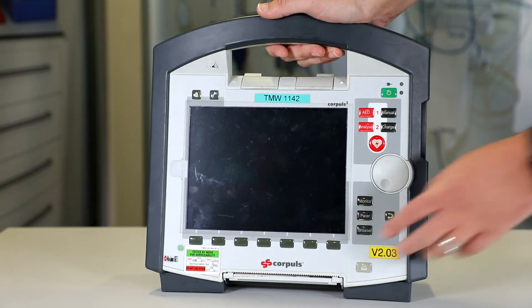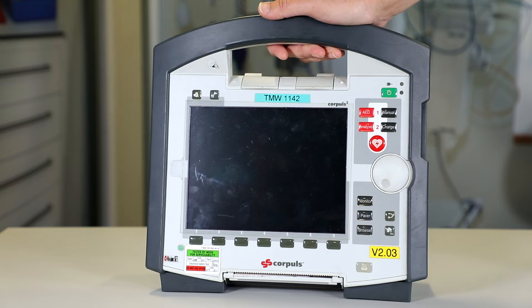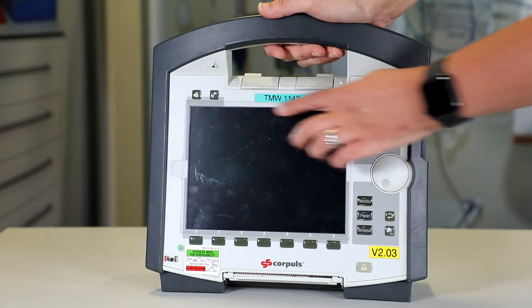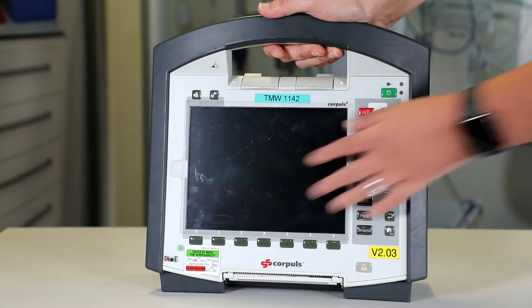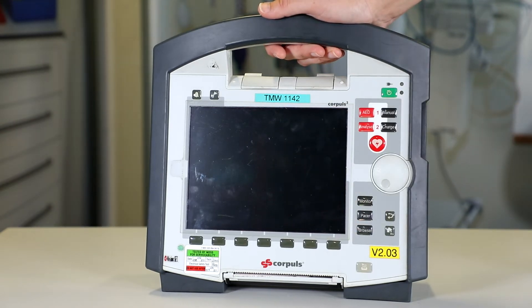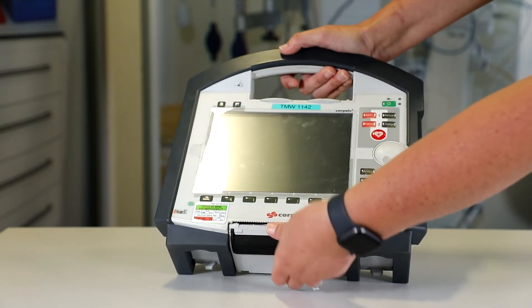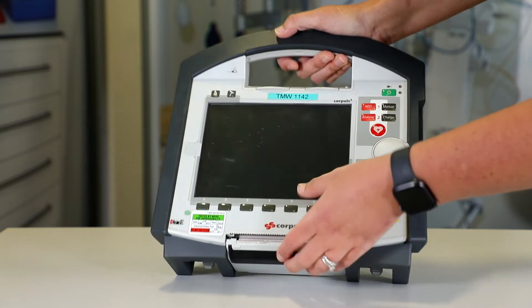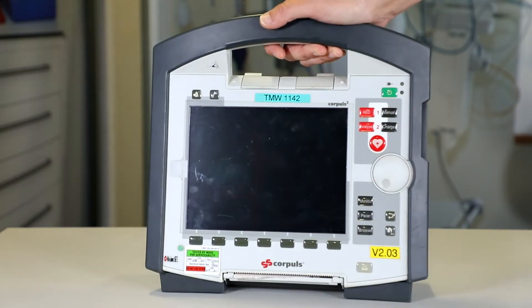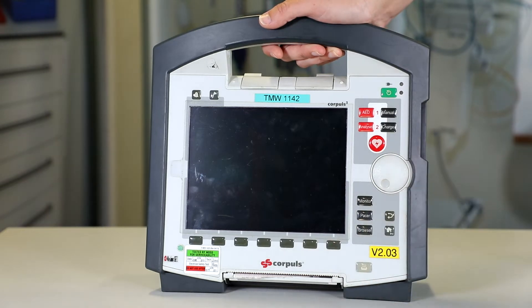I'm then going to have a look at the MDSS serviceability sticker and check that this is in date. The next thing I'm going to look at is the screen protector — I want to check that this piece of plastic is on and intact. Next I need to check my printer paper, so I'm just going to pull this clip down like so and check that I've got enough printer paper in there.